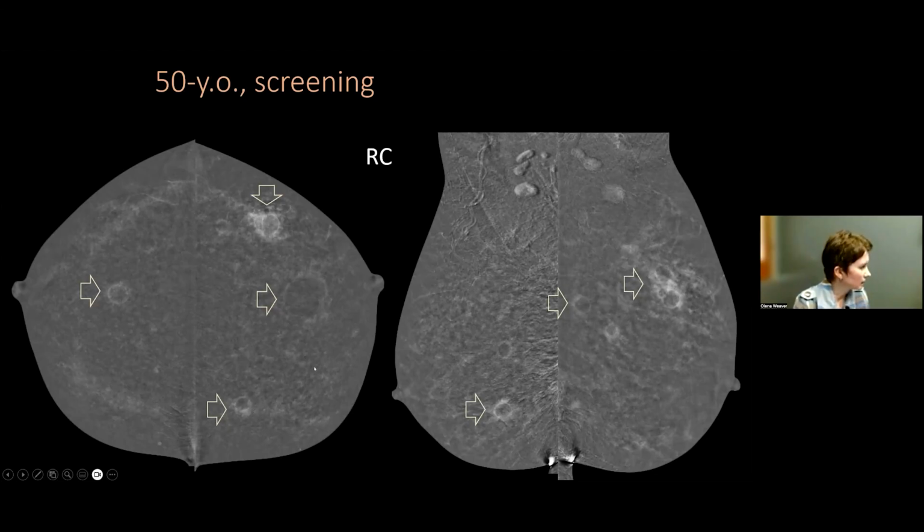So in this case, the multiplicity of these findings and the fact that we could see on the prior images that there were masses in this area and they actually fluctuated in size, we can think that the bilaterality and the more symmetric nature of it is more towards the benign nature of these findings, probably inflammatory cysts. But have to be careful with this.